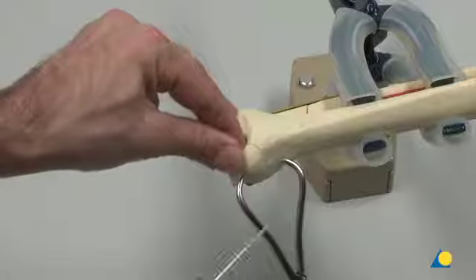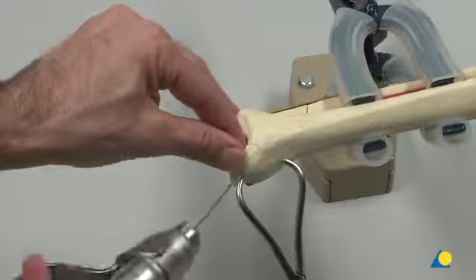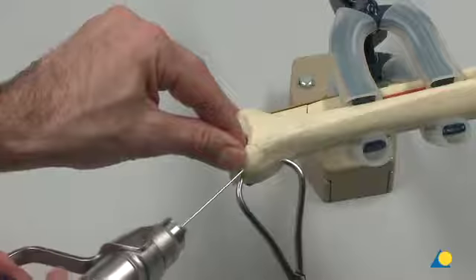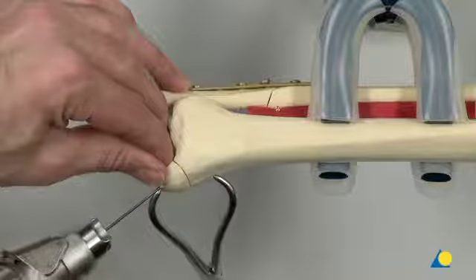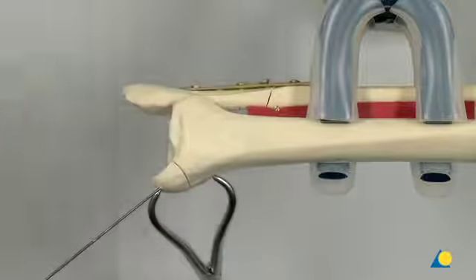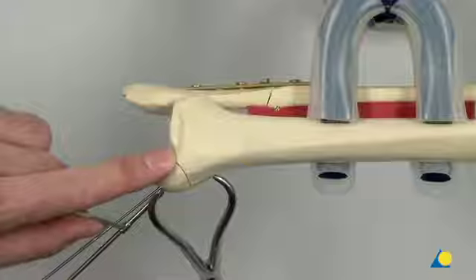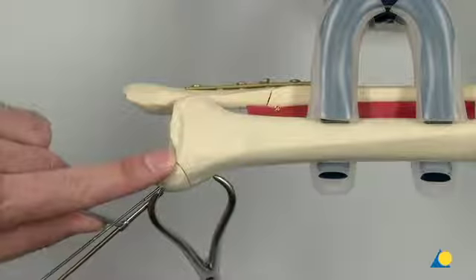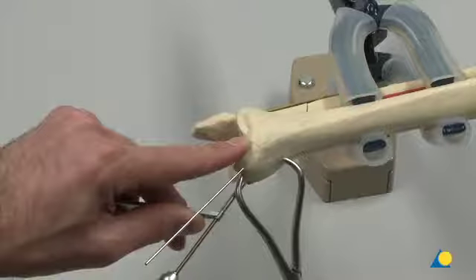A 1.6 mm K-wire is inserted to secure the preliminary fixation. Take care to ensure that the K-wire does not go through the joint. The 2.5 mm drill bit is used to drill a hole for the 4.0 mm cancellous bone screw parallel to the set K-wire.